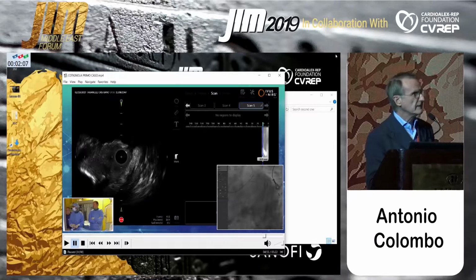The recoil, I think we have seen that the drug on the drug-coated balloon prevents or keeps the recoil minimal because it tends to give a positive remodeling. So I'm not afraid of recoil unless you have acute recoil. If you have acute recoil, that's a different story. But the way to prevent recoil is to do an aggressive predilatation. And you are not afraid to do an aggressive predilatation because you have a stent available.